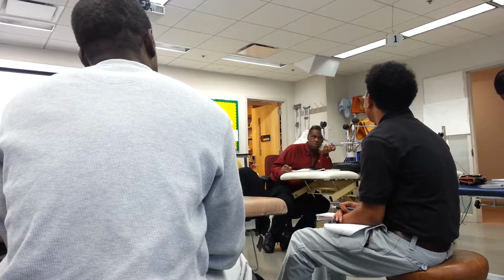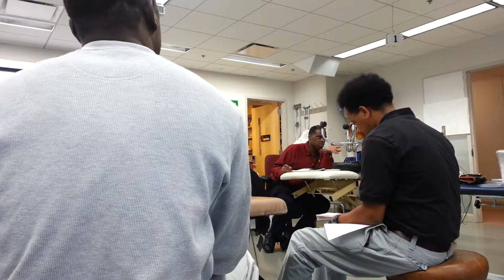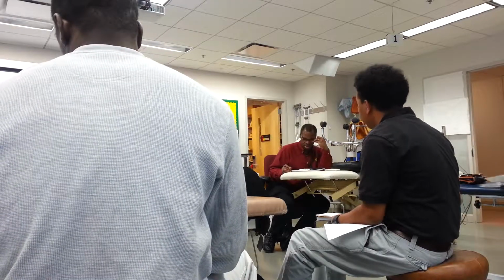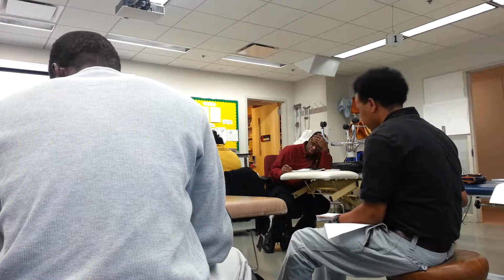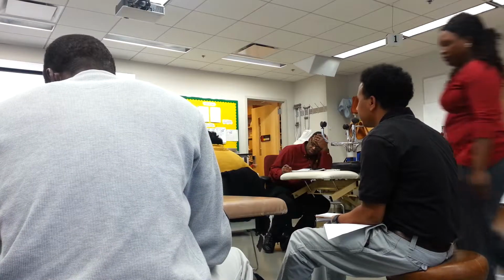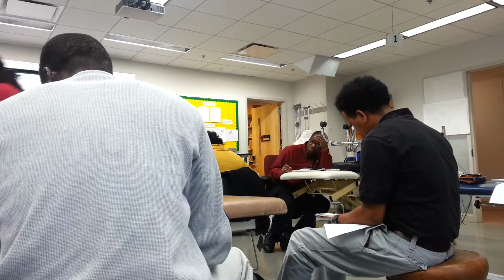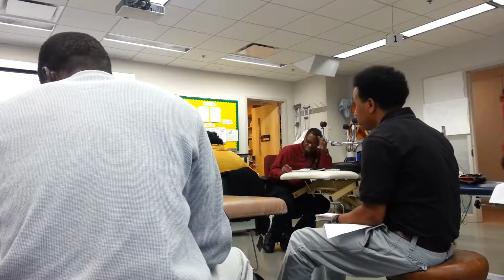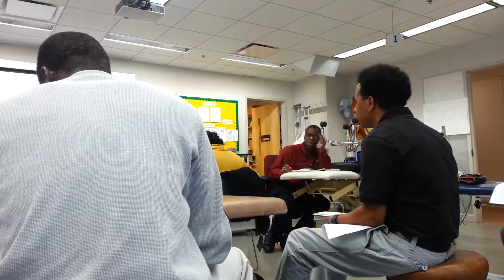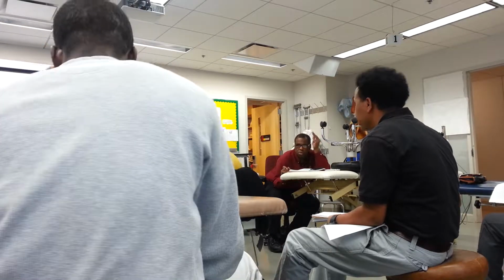All right. So I need a monophasic machine, if it's around, for doing something. Now, at the bottom it says a machine which has continuous, unidirectional, one-way, uninterrupted electrical charge particles, DC. Promotes physiological, chemical, and thermal changes. So that's why we want the monophasic machine. That's used for edema, pain, wound healing. So we're going to talk more about wound healing.